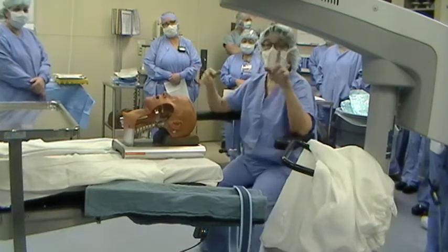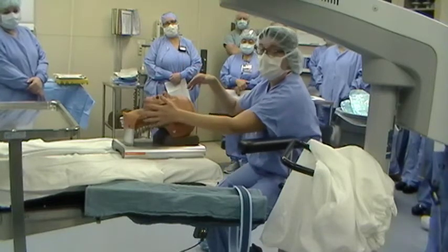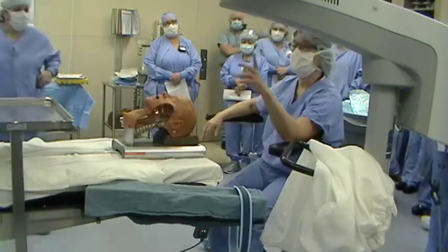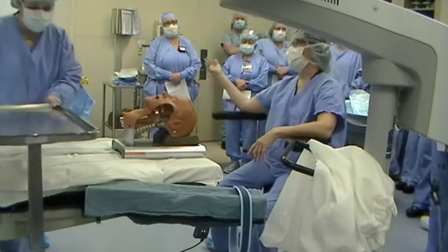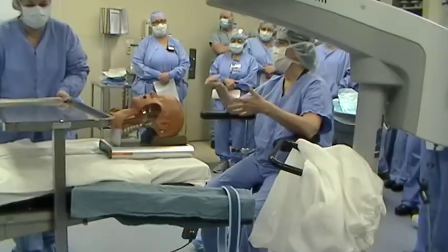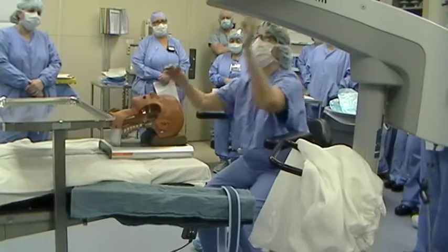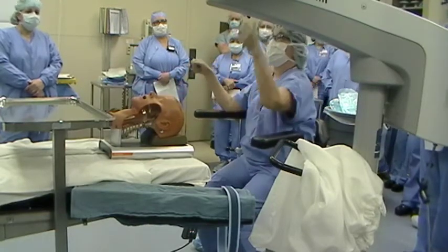I've moved this over so we have enough room that people can take a look if they want. The mannequin is actually open on this side to see the laryngoscope down. I am right-handed. I want my scrub on my right hand. She's going to hand the instruments and help me guide them in, especially because I can't see where the tip of the laryngoscope is in relation to the end of the instrument or my hand.